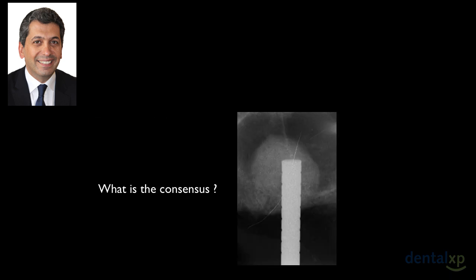But the final question that I would ask is, where is the consensus? We saw that in the report of the Sinus Conference 20 years ago, they had a consensus that said that whenever we had more than 6 millimeters of residual bone, we could do this internal sinus floor elevation. And whenever we had less than this, we had to do a crestal approach, a lateral approach. So let's see some cases.